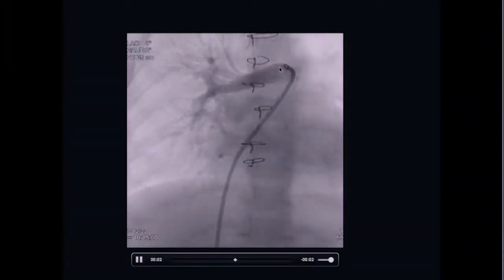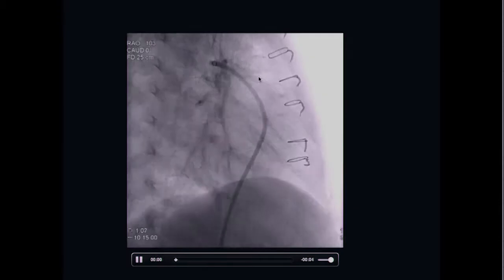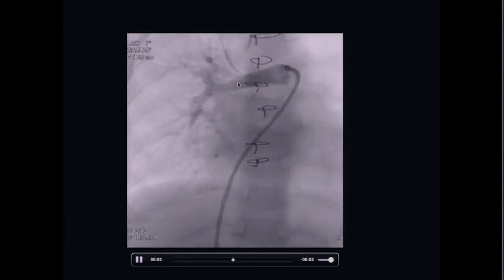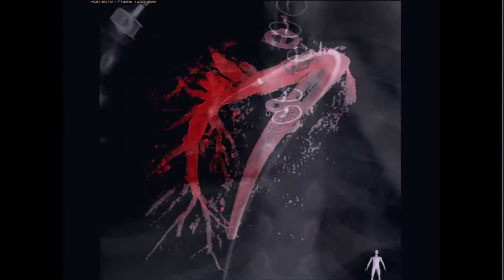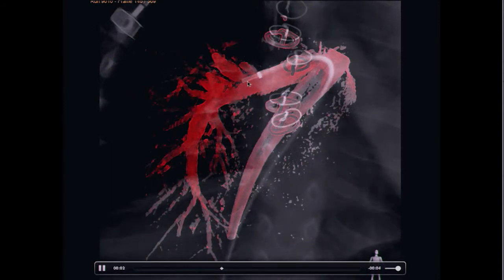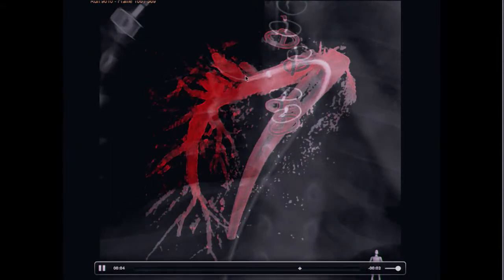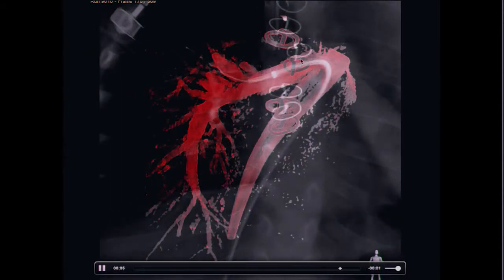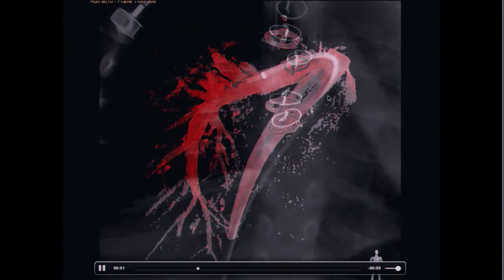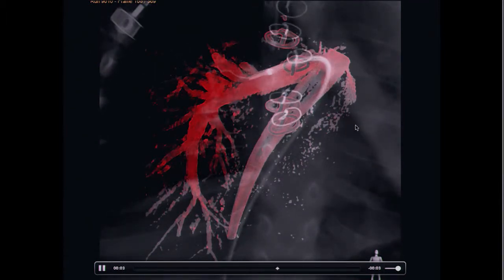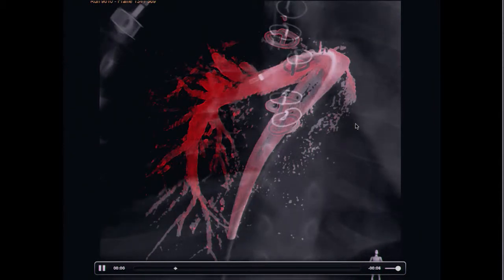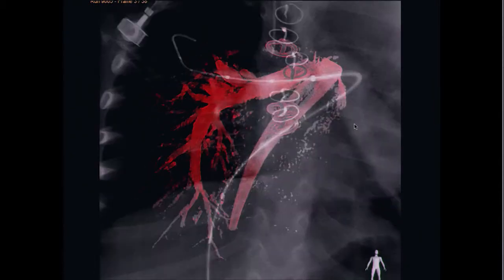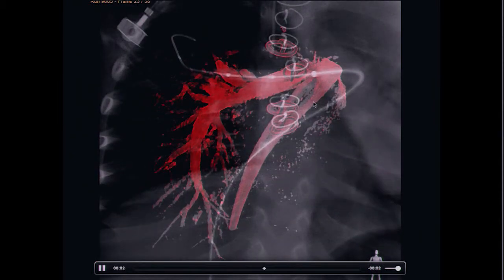After this, I used it for a peripheral pulmonary stenosis patient. As you can see, there are several stenoses, and I could select them easily using the 3D roadmap on the fluoroscopic image, as you could see this afternoon, and successfully balloon them.